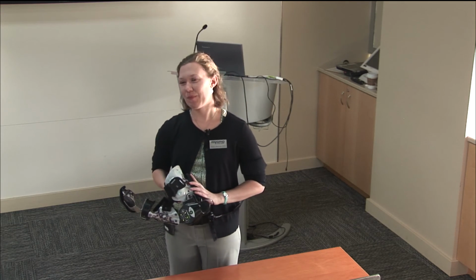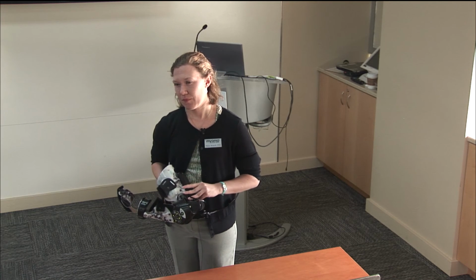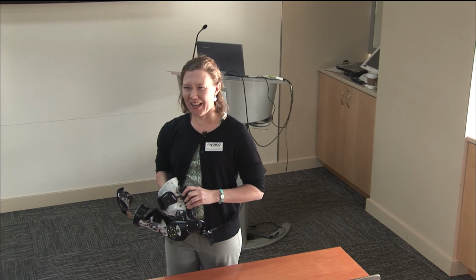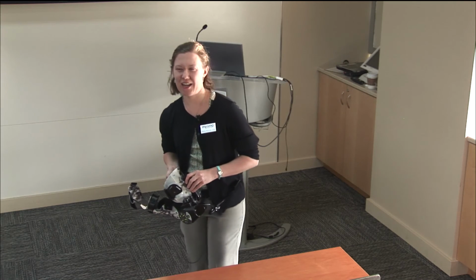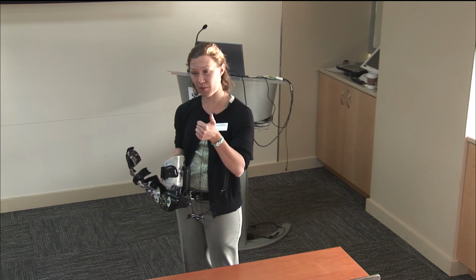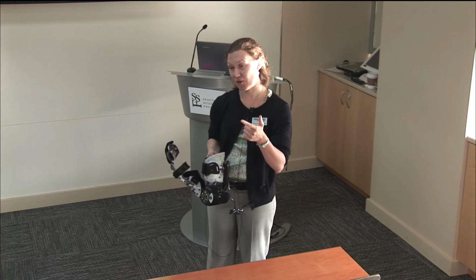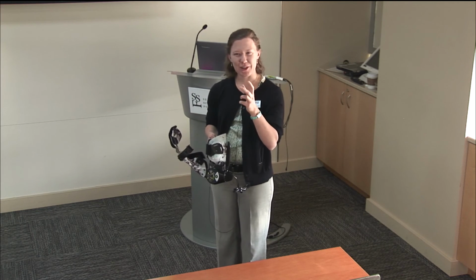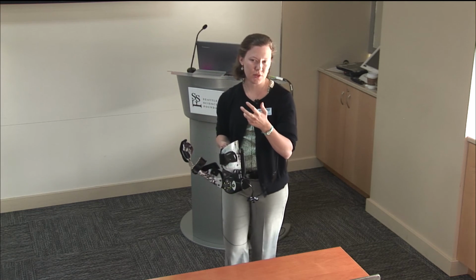It is. And what do patients find more helpful, the elbow flexion versus the elbow extension? I know it's probably dependent on each patient. It's totally patient dependent, for sure. And there are multiple modes on this. They can use it so that it responds to just the biceps. They can use it to where it responds to just the triceps, or they can use it in a dual mode. So it's kind of patient dependent on which one they like to use.